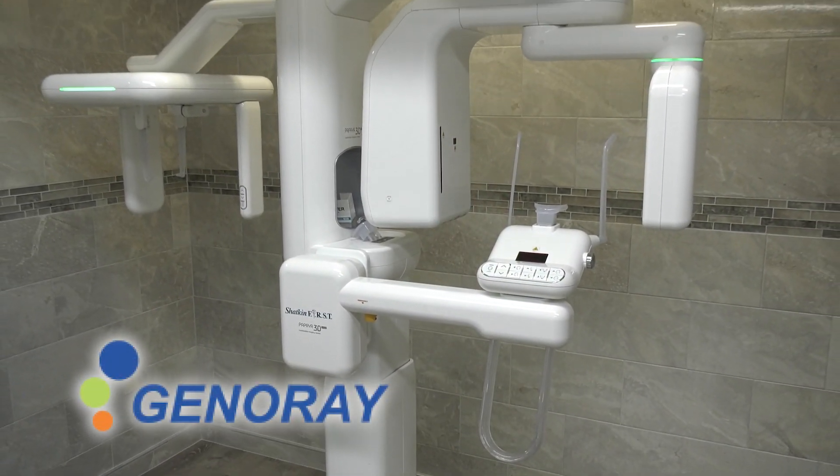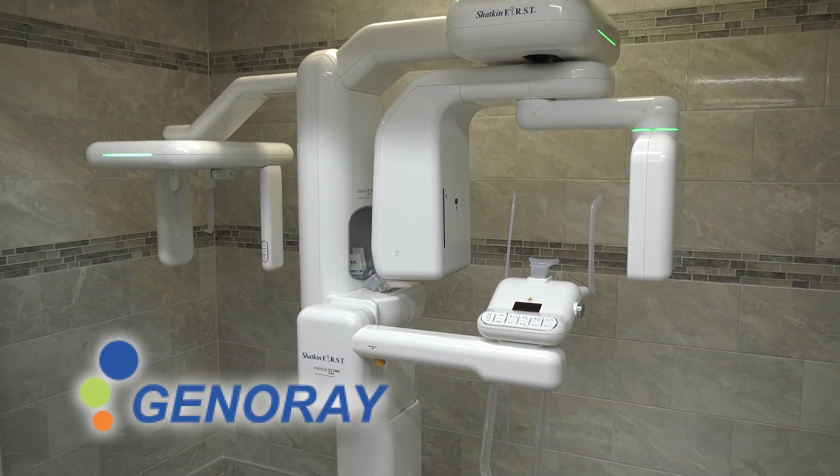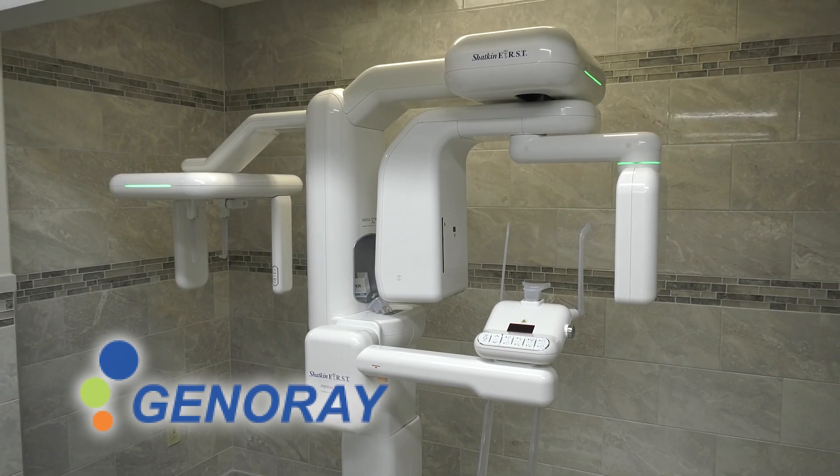So that begs the question — how many of you have cone beam CT machines in your office? I think now a large number of you do, but there are still some using panoramic or intraoral x-rays. I would encourage you to consider buying a cone beam CT. Shatkin First sells the Genoray 3D machine, and it's a wonderful machine.